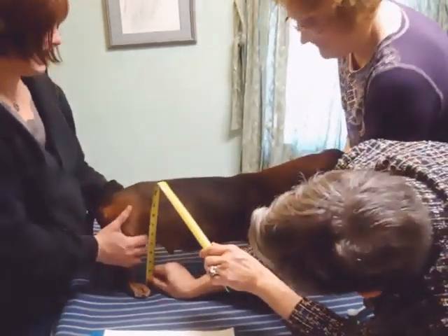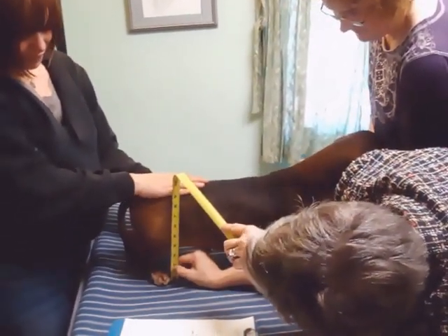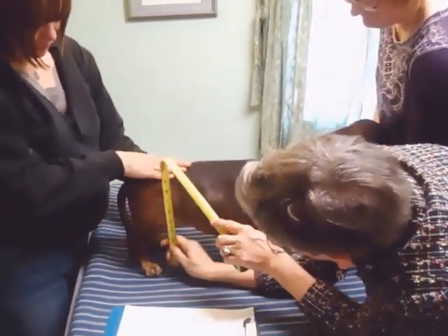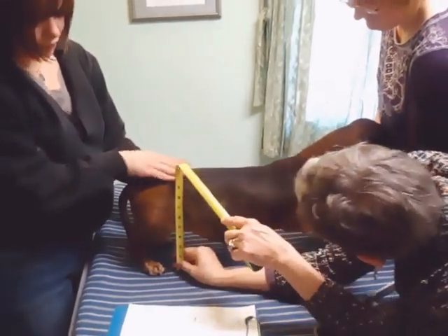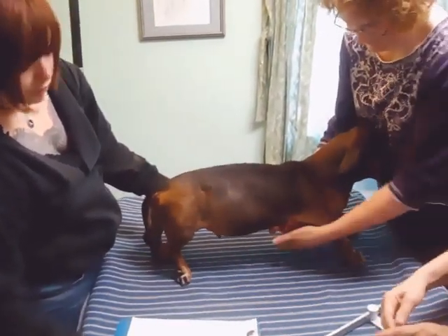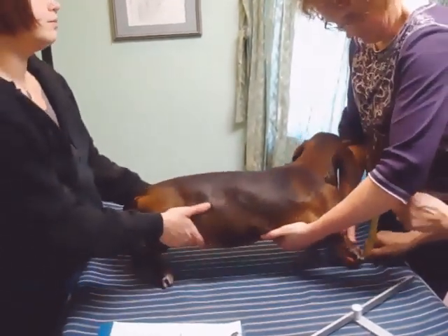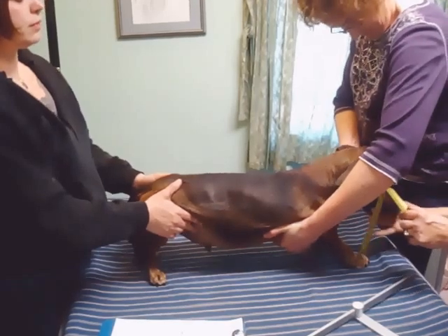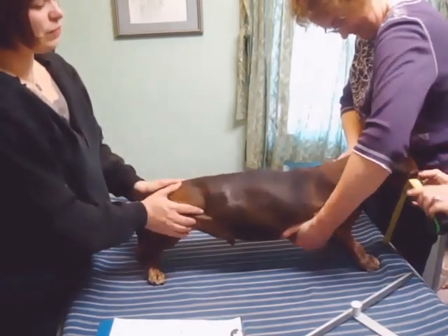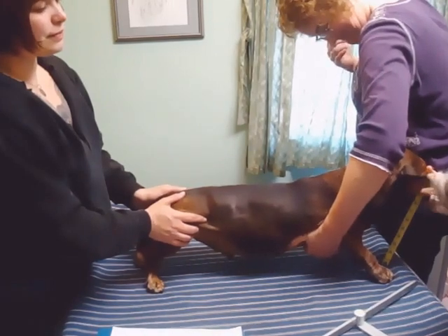J is the height of the rump, and if we have a level top line it should be almost the same as A. We get 10 — about 10 and a half — he's bracing a little in the front. If this dog were a wobbler and needed a headrest, we would measure from his chin to the floor. I don't think he needs a headrest, but if he did, it would be seven and a half.